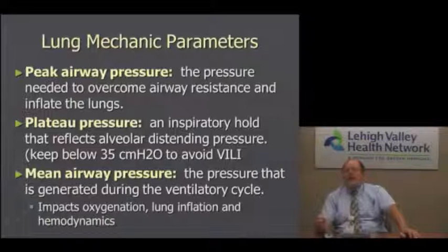What do these mean? Peak airway pressure is the pressure needed to overcome airway resistance and inflate the lung. It's an important number, don't get me wrong. Usually if peak airway pressures are high, it's a serious assessment and we have to do something about it. But keep in mind, it's not necessarily what the lungs see.